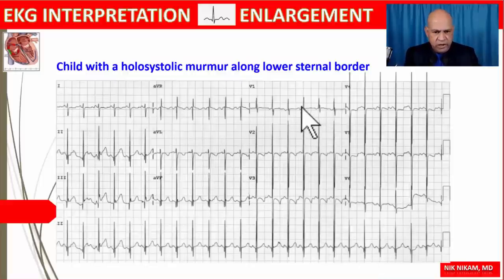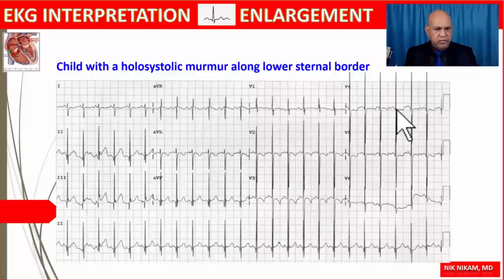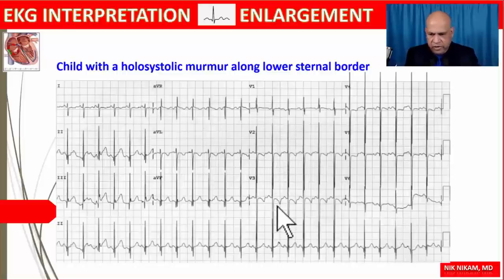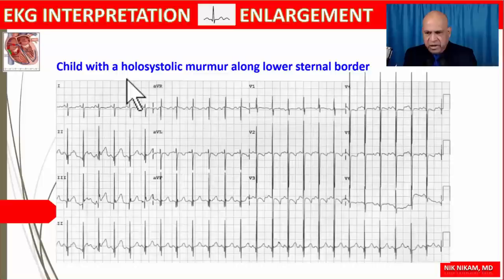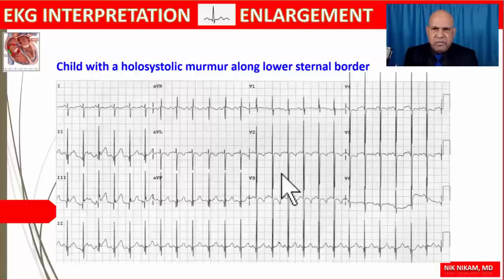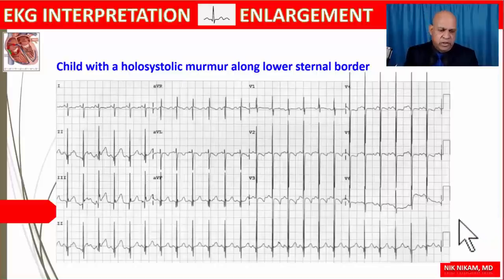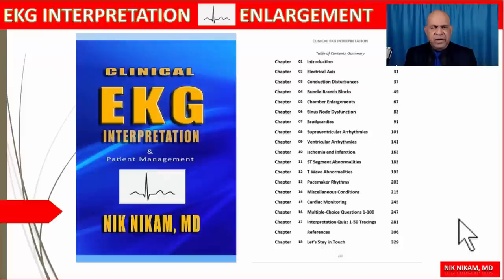Here is another tracing. We have sinus tachycardia at 150 per minute, right axis deviation, right ventricular hypertrophy, left ventricular hypertrophy, non-specific STT changes in the lateral leads, and discordant changes in the anterior leads. The clinical clue: this is a child with a holosystolic murmur along the lower sternal border. A ventricular septal defect produces right and left ventricular hypertrophy in a child with right axis deviation and possible left atrial enlargement, and is associated with a holosystolic murmur heard best at the lower sternal border.